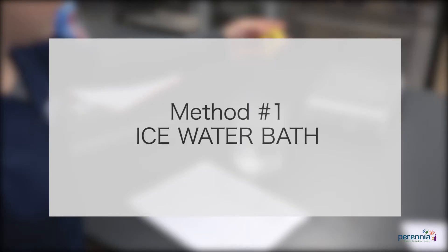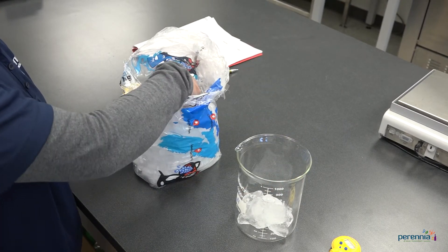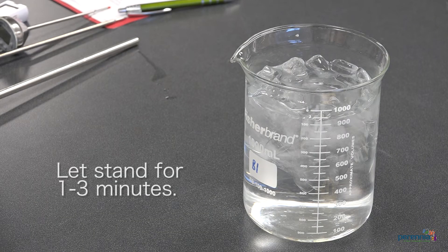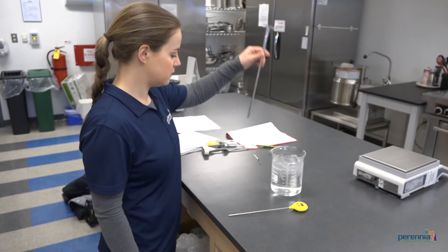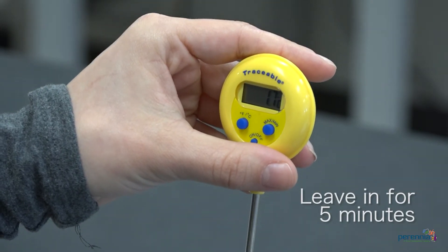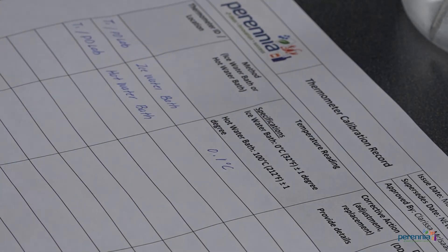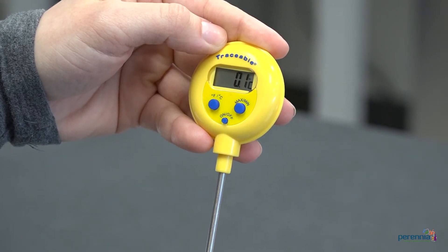The first method we will demonstrate is using an ice water bath. Step one: fill a container with ice cubes and cold water and stir the water. Let the container stand for one to three minutes. Step two: stir the water again and place the thermometer in the bath without touching the sides or bottom of the container. Leave the thermometer in the container for at least five minutes. Step three: read and record the temperature. The thermometer must read zero degrees Celsius or 32 degrees Fahrenheit, plus or minus one degree.